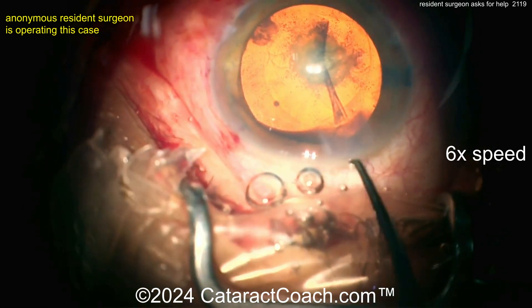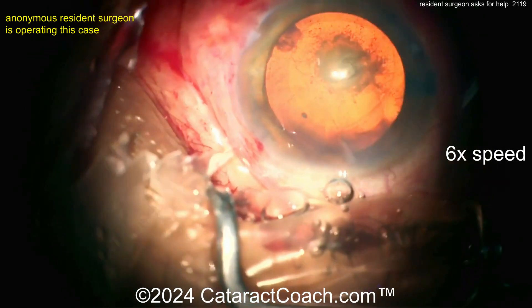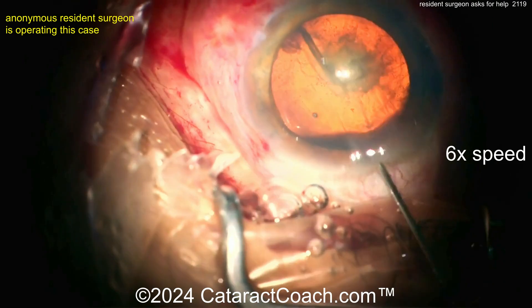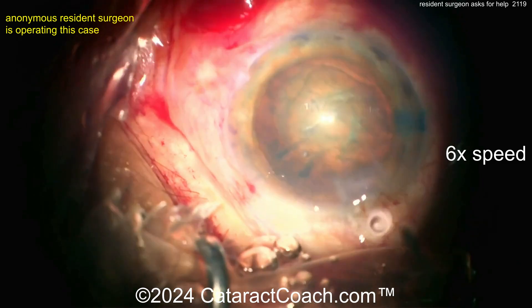Can you imagine if we watched this in real time how long it would take? It's normal to be slow at case number 20 — this is okay, you're a beginner. Let's see the hydrodissection here. I don't like the hydrodissection right across the nucleus because then you don't have room for it to come up if it needs to.